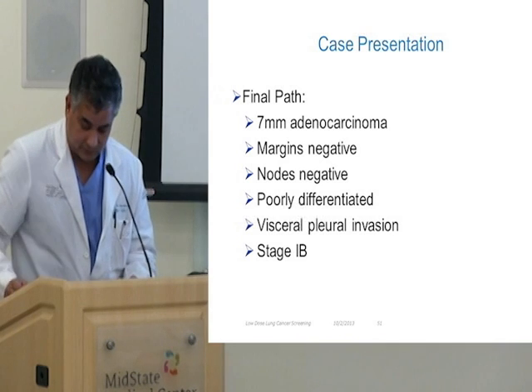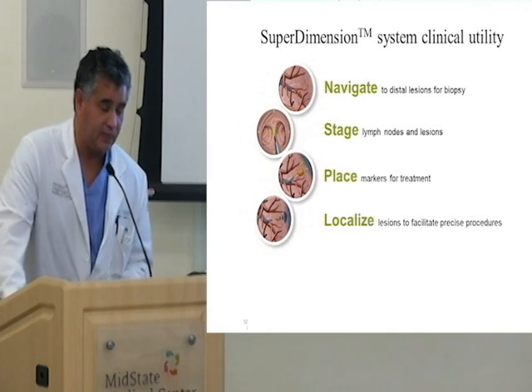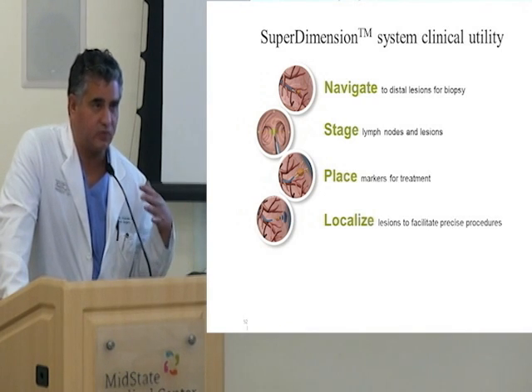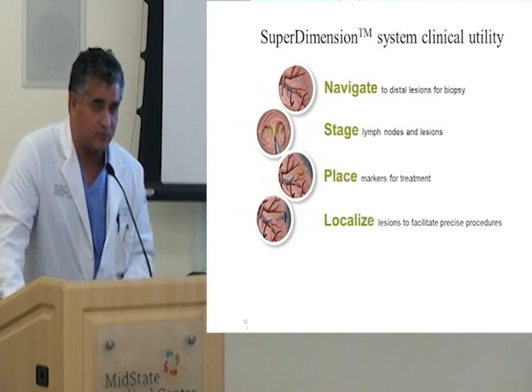So once again, just to review the types of capabilities this technology has, it's not only to be able to navigate to lesions and to biopsy them, but to also biopsy lymph nodes, and also to place markers to guide treatment and to localize lesions for intraoperative resection.